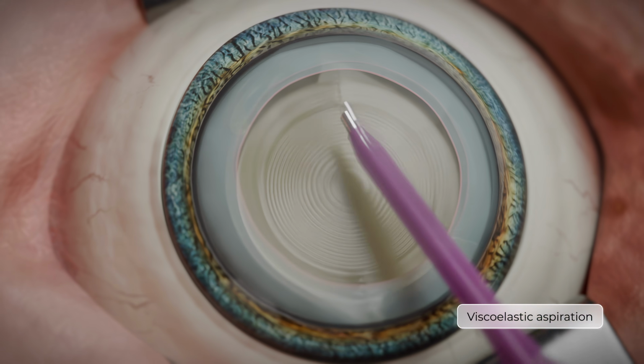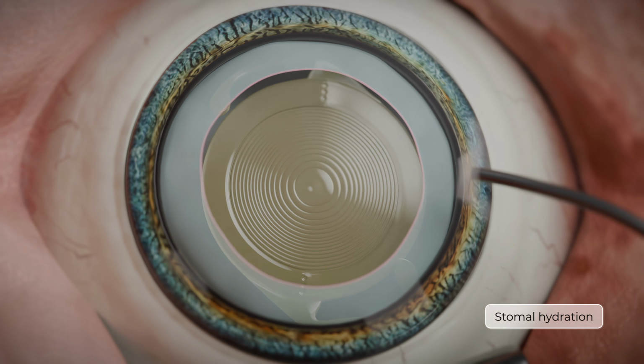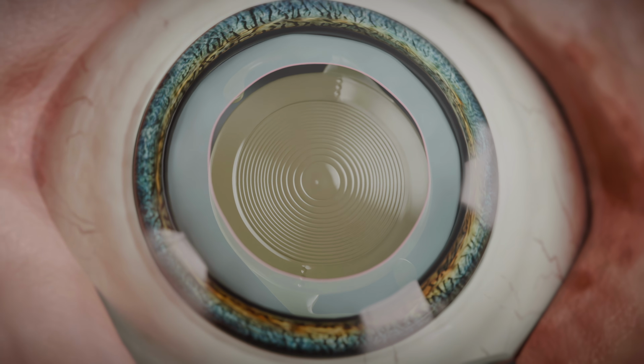Before the final stage of the surgery, to prevent secondary hypertension in the early postoperative period, the viscoelastic is removed using an irrigation aspiration system. The final stage of the procedure is hydration of the paracentesis edges to ensure complete sealing.